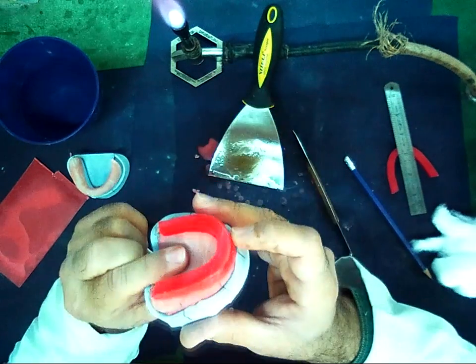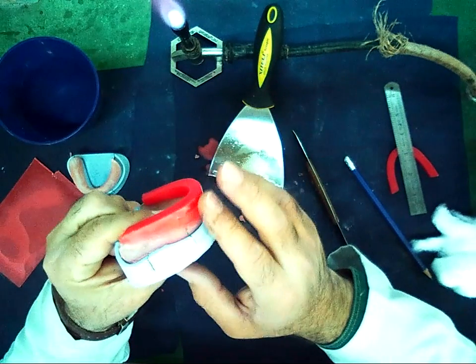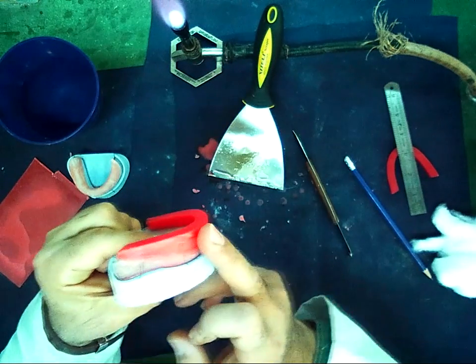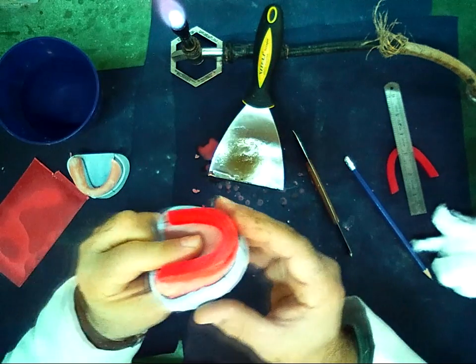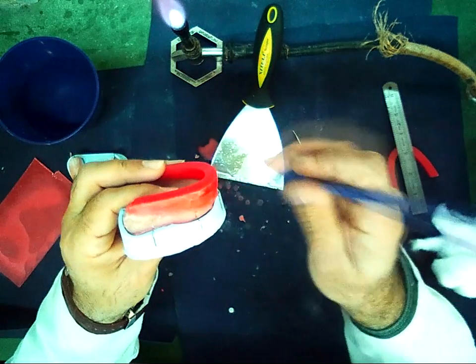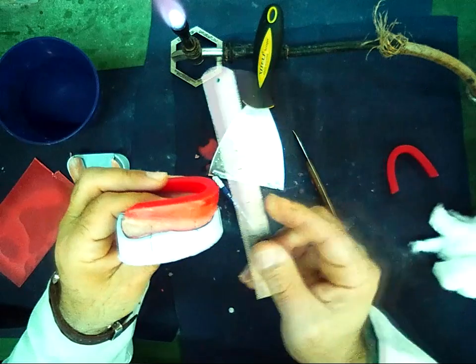First, I should be sure that the inclination of the anterior part of the wax rim should be 2 mm only, not more than 2 mm. If I want to be sure that it is 2 mm, I should put the pen or the ruler.